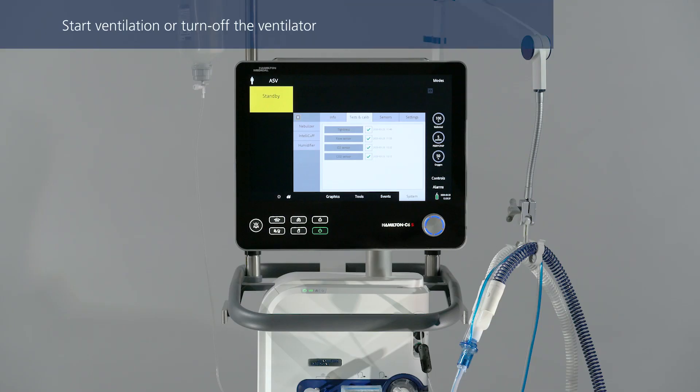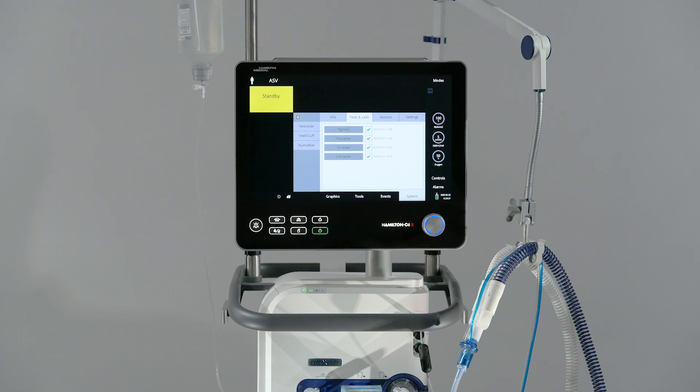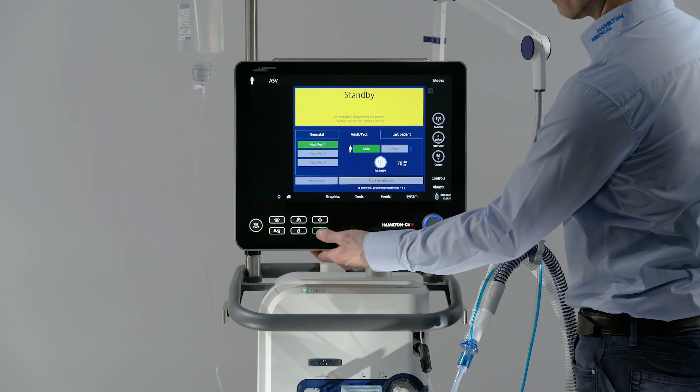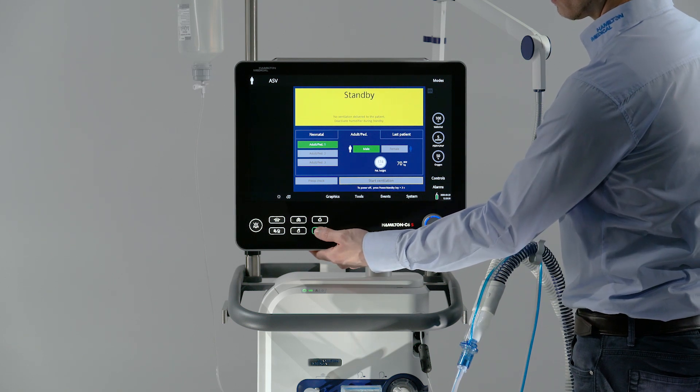Once you have completed the pre-operational checks, the ventilator is ready for use. You can set up the ventilator for a particular patient and start ventilation, or you can turn off the ventilator and keep it stored away, ready for use. All the test results of the pre-operational checks will remain stored in the memory, even when the ventilator is turned off. Make sure the setup that you calibrated is not changed or altered while the ventilator is in storage. To turn off the ventilator, press and hold the power standby key for about 3 seconds.